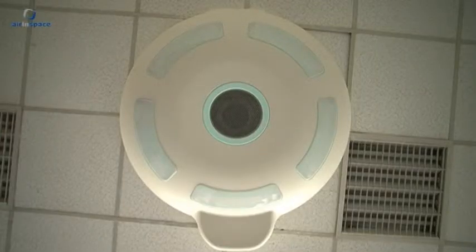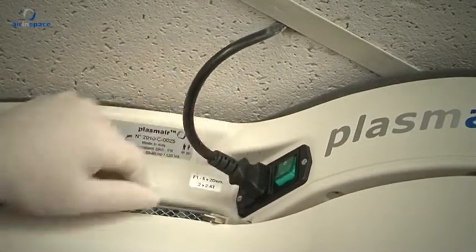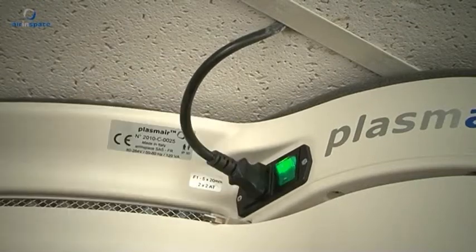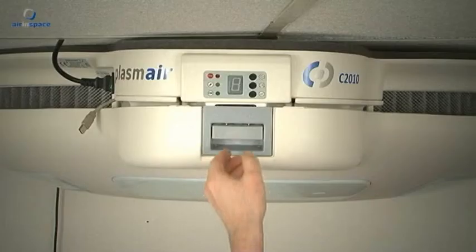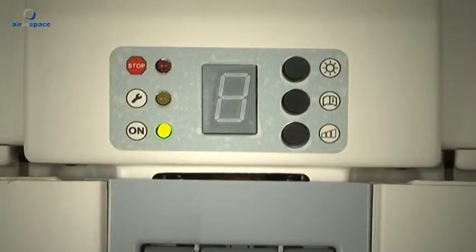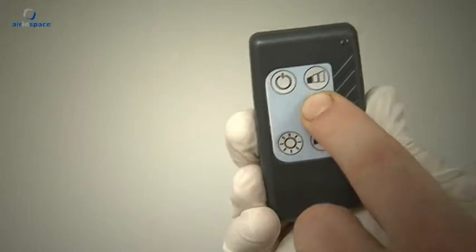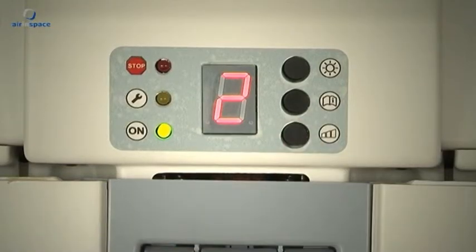Switching on the device: Ensure that the Plasmair C2010 is connected to the electrical supply. When switched on, the handle on the cover locks for safety reasons and the piloting program is loaded. This launch sequence can last five to ten seconds. Select the appropriate ventilation speed using the remote control or the speed button on the panel. When the green light comes on, the Plasmair C2010 is working properly.